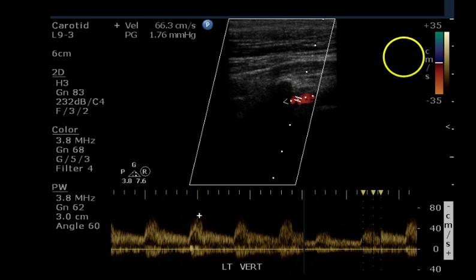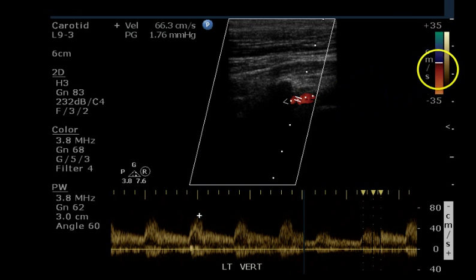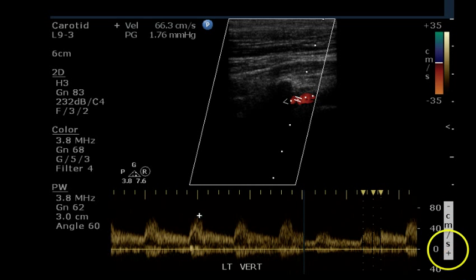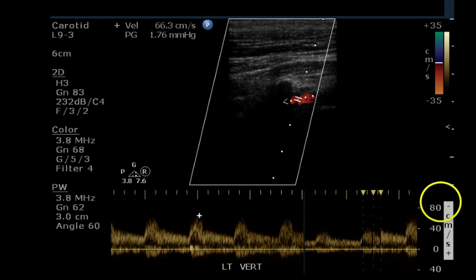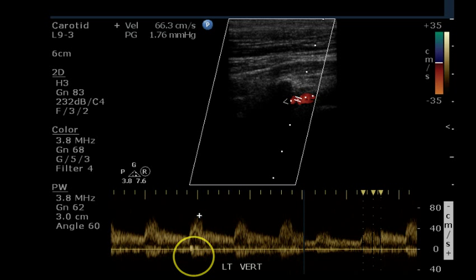Vertebral arteries should be flowing downward as we go from right to left, and that is the case. We have red at the bottom of the color bar because we have inverted our scale — the minus is on top — so that flow away from the transducer appears on top of the line.